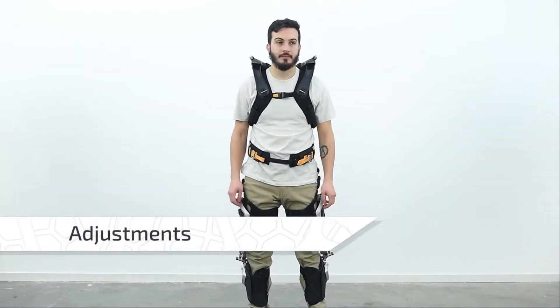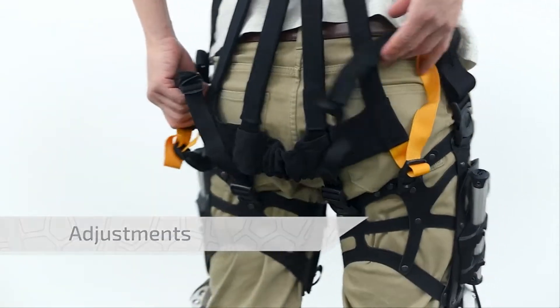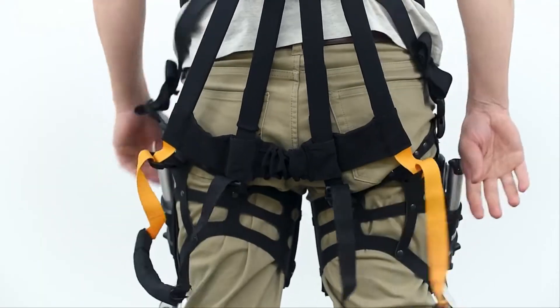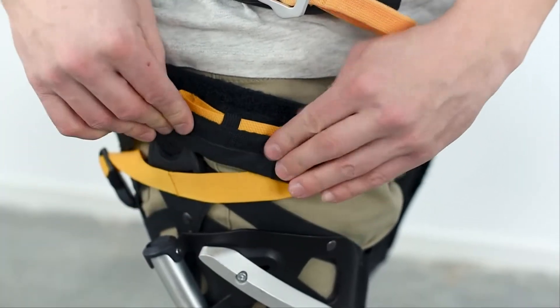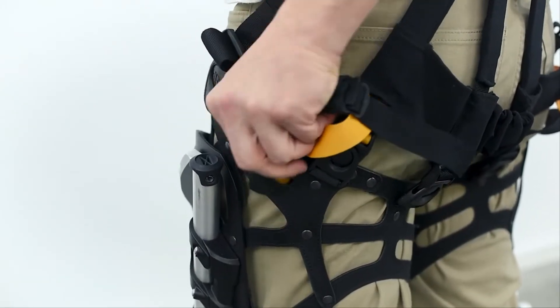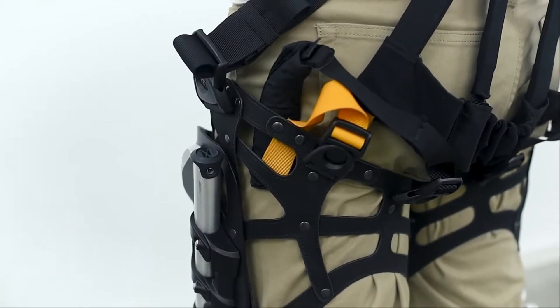To properly fit the module, begin by evenly pulling the straps on the back of the thighs until a slight tension is felt on the back elastic. Any extra length of these straps can be stored within the handle. To reduce the risk of snagging, the entire handle can be tucked inside the harness itself.